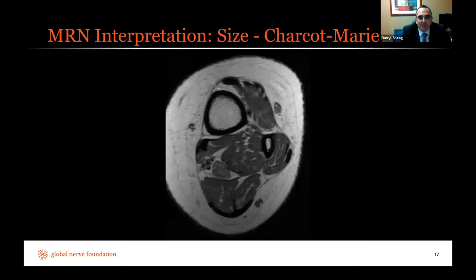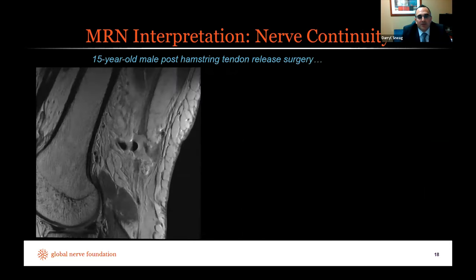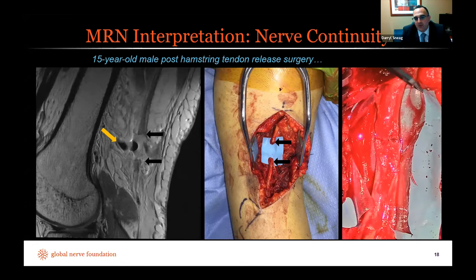In the lower limb, patients with Charcot-Marie-Tooth disease have enlarged tibial, sural, and superficial peroneal nerves in the distal lower leg. A 15-year-old male underwent hamstring tendon release surgery and, at the time of release, the common peroneal nerve — just as it bifurcated from the sciatic nerve — was lacerated. Here are the proximal and distal ends of the cut nerve with foci of air at the operative site. The patient was taken to surgery by a colleague, the nerve ends were found, and the nerve was repaired.